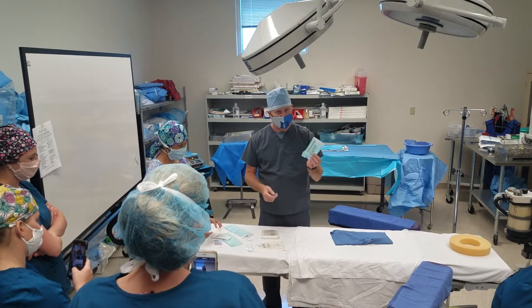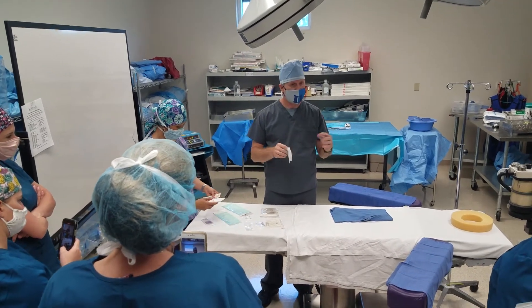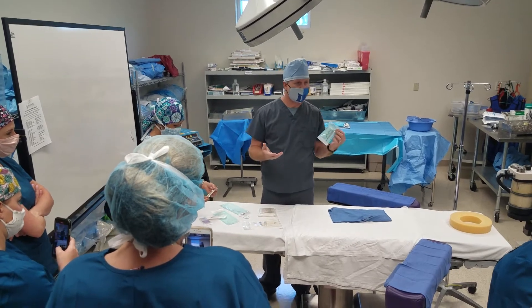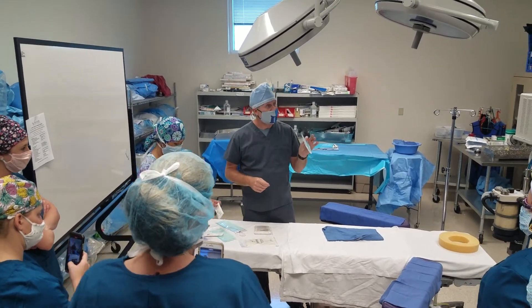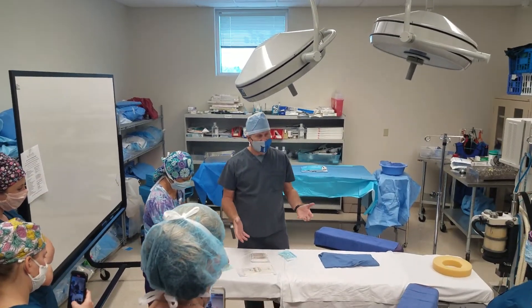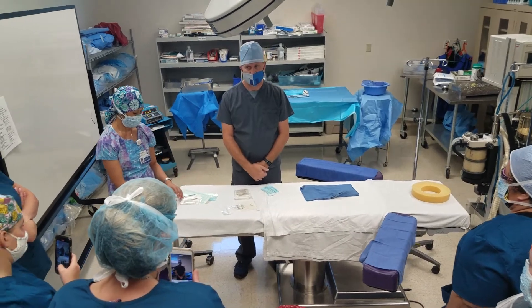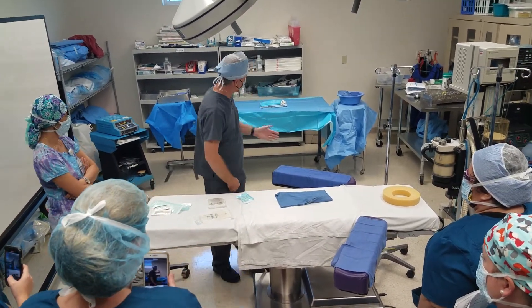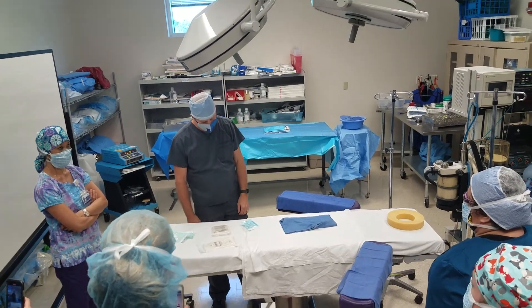This is a peel pack that we made here — it's got a little indicator in there. We don't have a sterilizer, so the indicator won't change color; we don't have the capacity to do that. We're going to go through the motions and say we've sterilized these things. Where are we going to open this stuff? On the sterile field, right? I've just created the sterile field, so I have all this area to open things into.